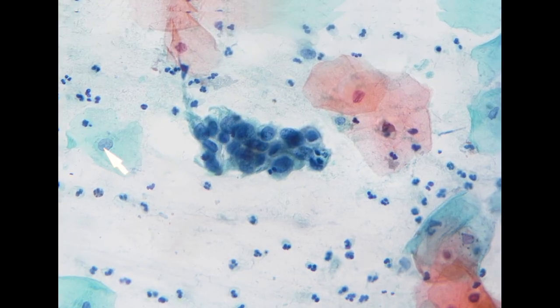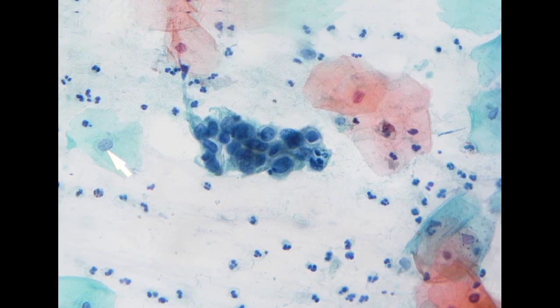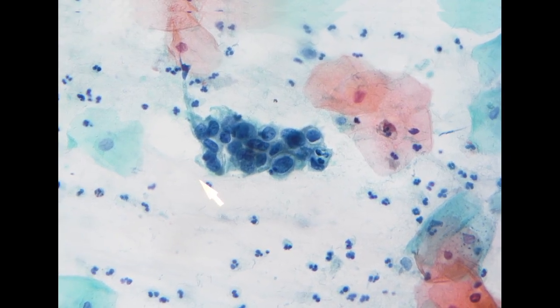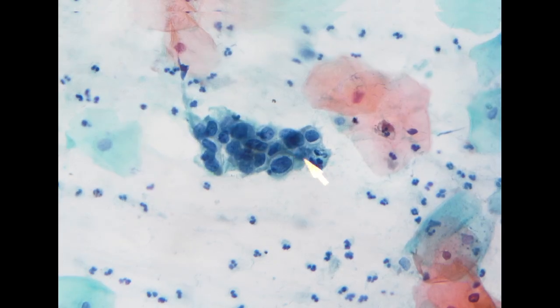So we do have our reference cell, the intermediate cell nucleus. Some of the cells are slightly bigger than the intermediate cell nucleus, but you see the chromatin pattern is really hyperchromatic. With these fragments of cells, it is a little bit difficult to determine whether these are squamous cells or glandular cells. Remember, when we see a hyperchromatic crowded group, the first thing we need to do is differentiate whether this is squamous or glandular.